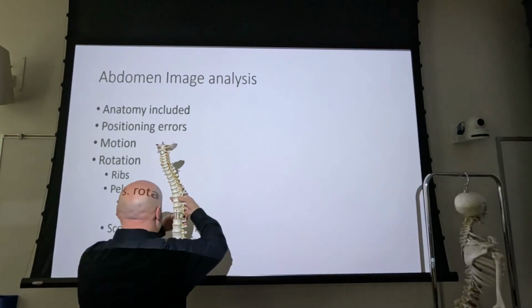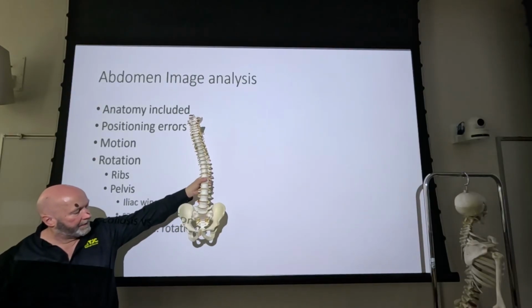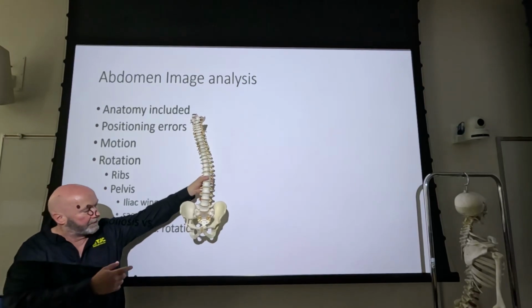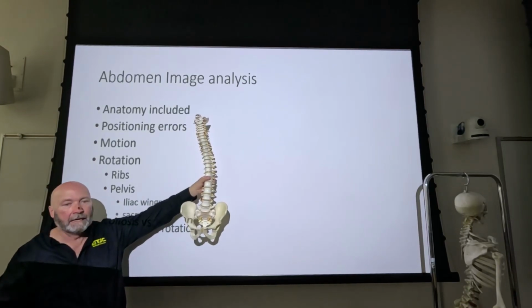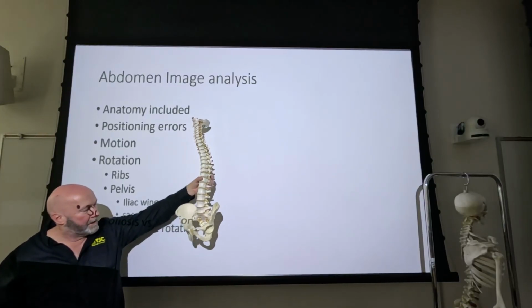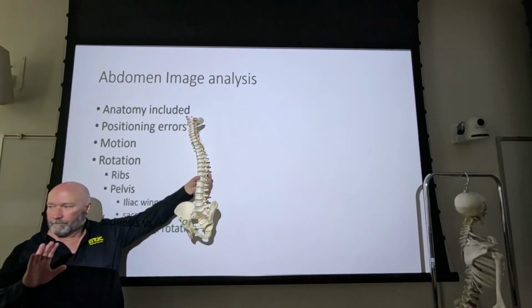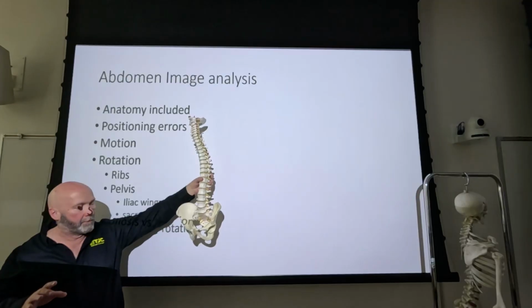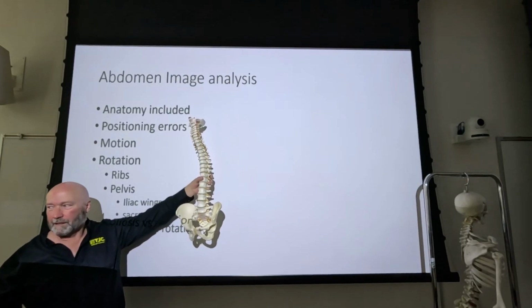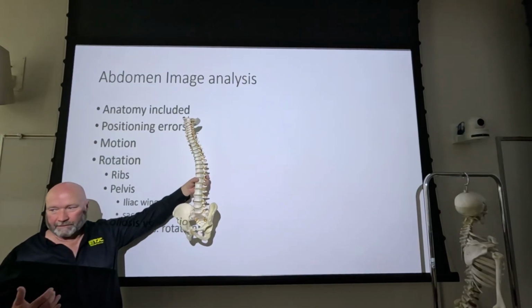Can you still see? Yeah, you can still see. Look what happens to the appearance of everything, really, the anterior pelvic bones, the pelvic wings, and also the position of the sacrum and the coccyx within the pelvis. So I'll go into an RPO, and what happens to the left iliac wing? Becomes more vertical, right? Much more narrow, as opposed to the downside appears to be elongated. It's not really elongated, right? It just appears that way because it's more parallel to the image receptor.